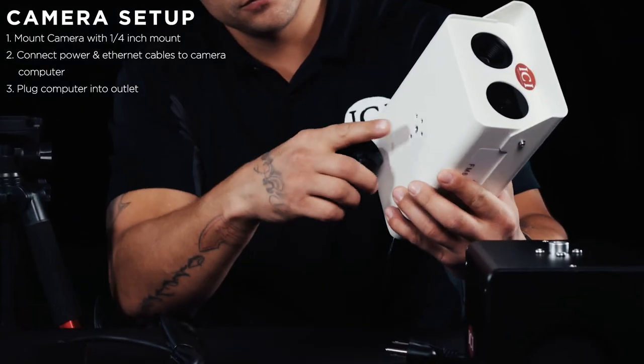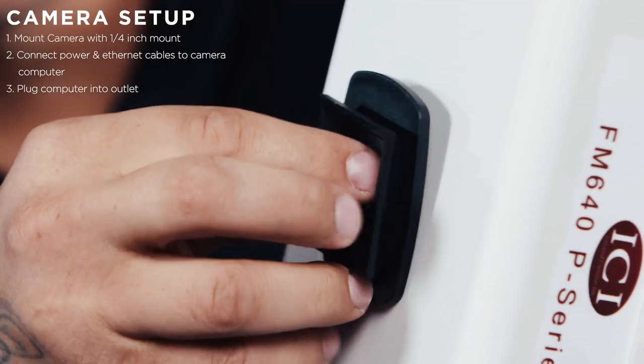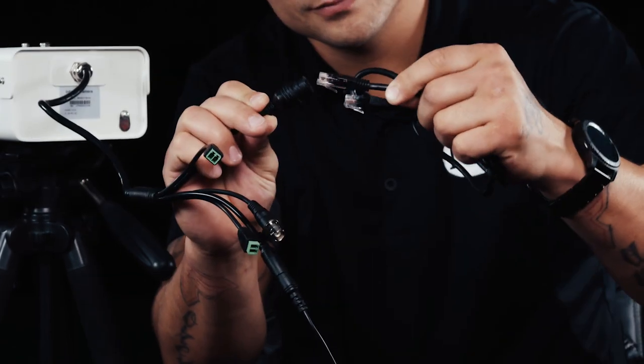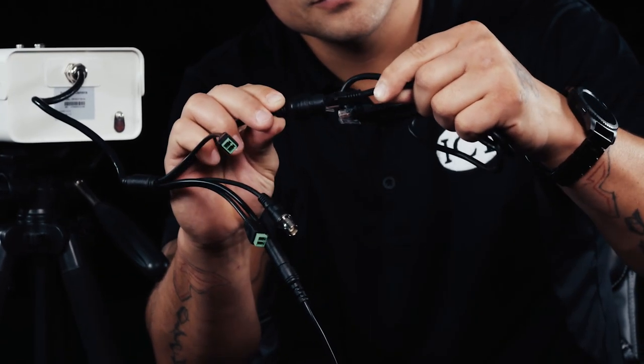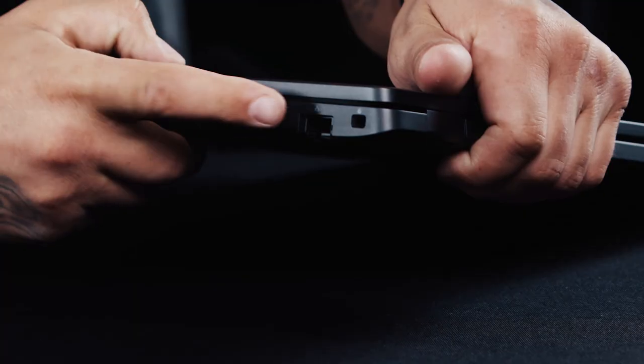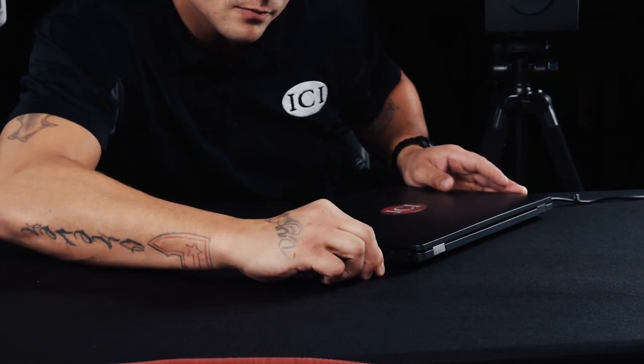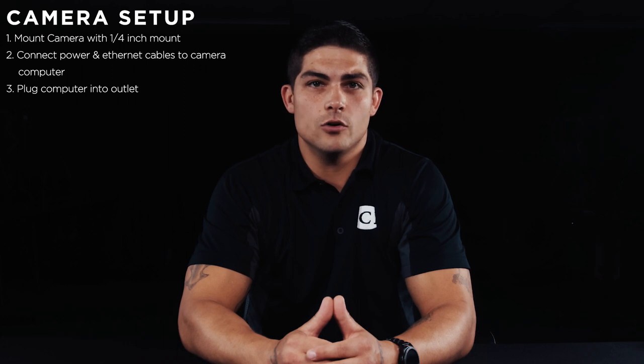During this section we are going to mount the camera using the quarter-20 mounts on the bottom of the camera. Plug both the power and the ethernet data combo cable into the appropriate ports on the back of the camera. Plug the free ends of these cables into the ethernet and USB ports on the computer. The camera may also be powered by a five-volt power cord connected to an electrical outlet.